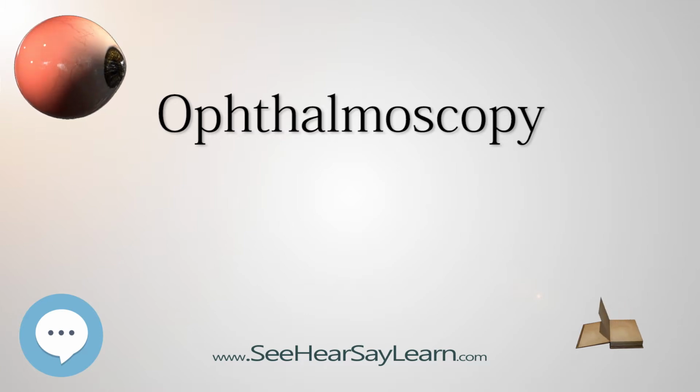History. Dr. William Cumming in 1846 at the Royal London Ophthalmic Hospital, later Moorfields Eye Hospital, of his pioneering work wrote, "Every eye could be made luminous if the axis from a source of illumination directed towards a person's eye and the line of vision of the observer were coincident." Although some credit the invention of the ophthalmoscope to Charles Babbage in 1847, it was not until it was independently reinvented by Hermann von Helmholtz in 1851 that its usefulness was recognized. It was to revolutionize ophthalmology.